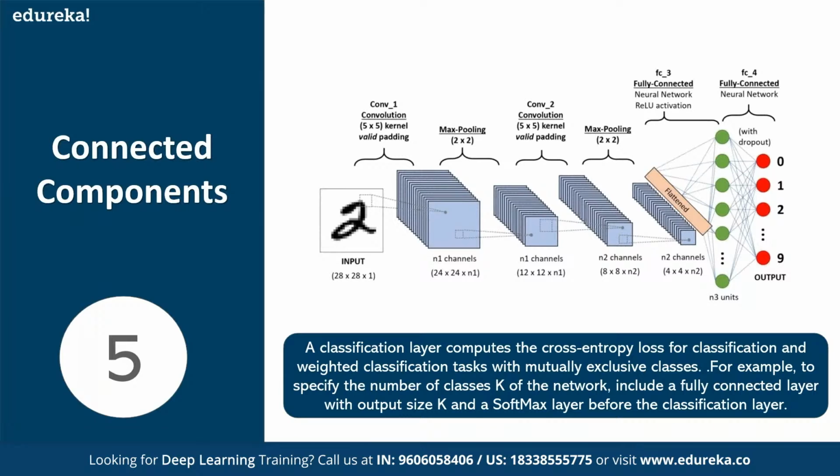At the end, I will have a flatten layer, which will help me to convert the data which is in multiple dimensions into a single dimension. And this flattened data is connected to a dense layer, which overall helps me in getting the image features and also processing with the help of the dense network. And at the end, we will have an output layer. So this is how a typical convolutional neural network is structured.